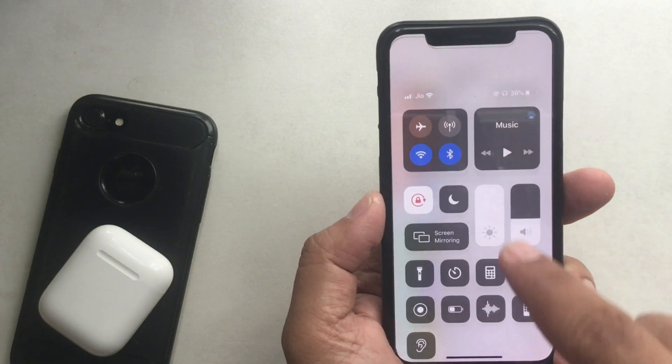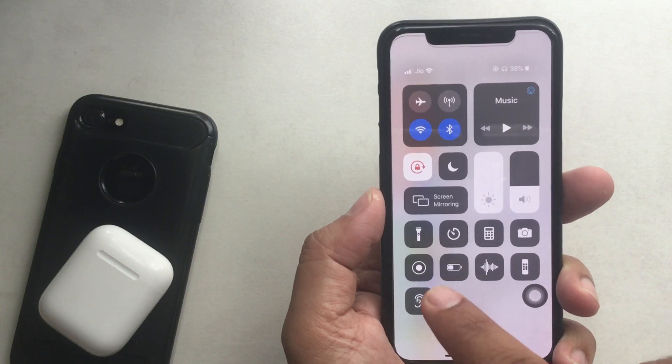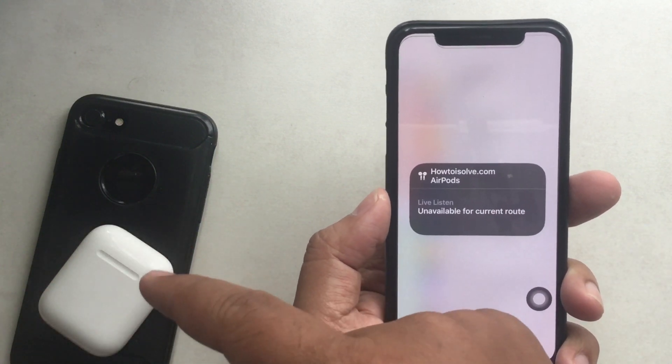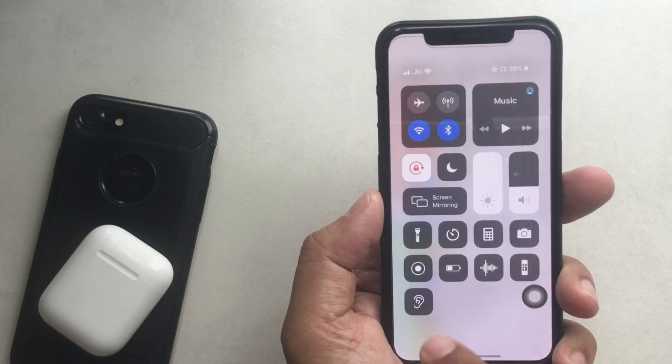Now let's open Control Center and make sure the Hearing tab is present on the panel — and yes, it's available. When I tap on it, a popup appears with the message 'Unavailable for the current route' because AirPods is not connected. Therefore, you must pair your wireless earbuds to activate LiveListen.